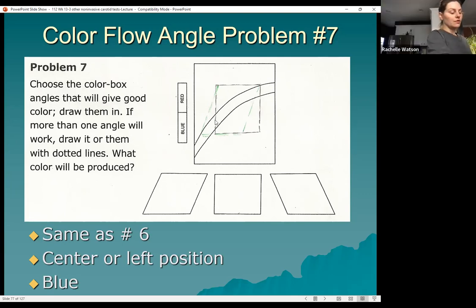So would the boards accept an answer like that, rather than moving it over a little bit? If you had to choose which is the best, steering is the best. Doing your steer would be the better answer. Is that usually what they do? Like, what is the best answer? Best, yeah.